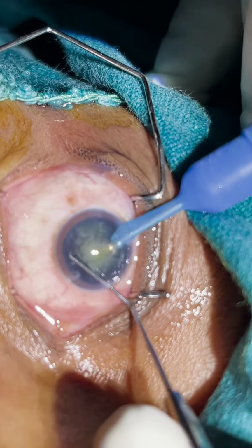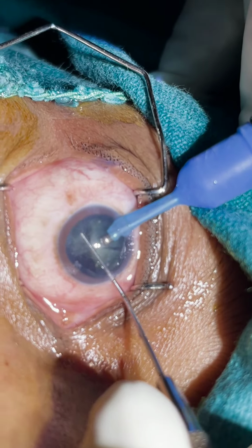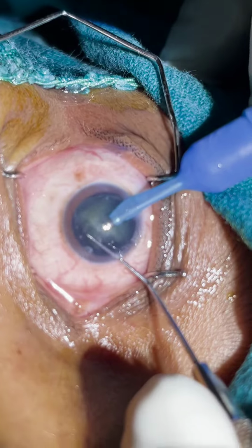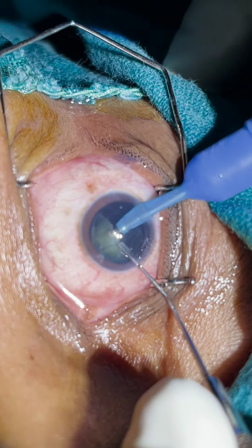Bringing the pieces to the center of the pupil and emulsifying at the plane of the iris, or maybe a little beneath the iris plane. Never ever emulsify them directly.